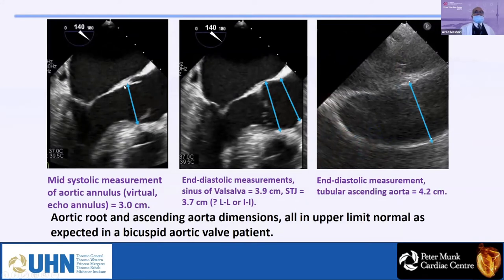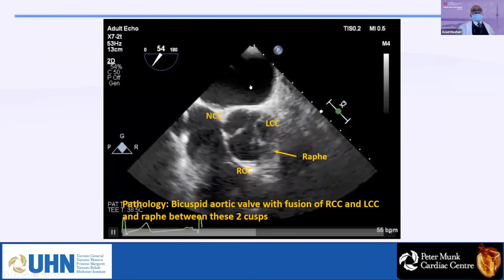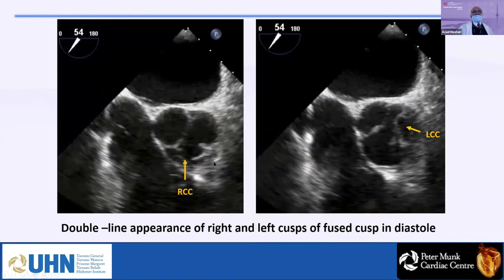Some measurements: the annulus is 30 mm. Bicuspid aortic valve annulus is never truly normal — it's at the upper limit of normal. The sinus of Valsalva is 3.9, still in the normal range. The tubular aorta is 4.2 cm — this type of dilatation is seen in all bicuspid aortic valves. The double shadow echo sign of prolapse applies to both tri-leaflet and bi-leaflet valves.